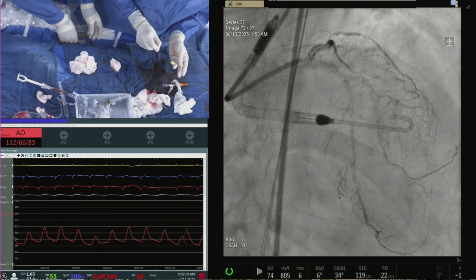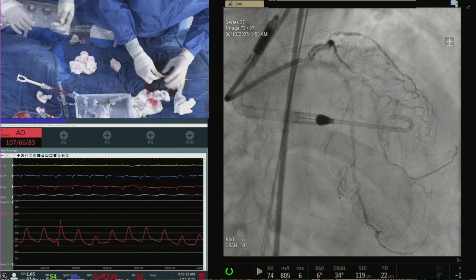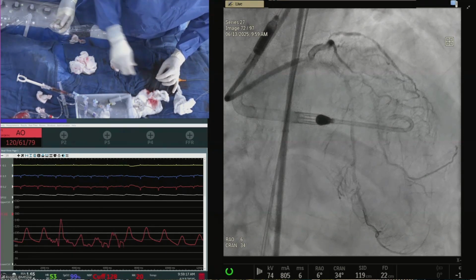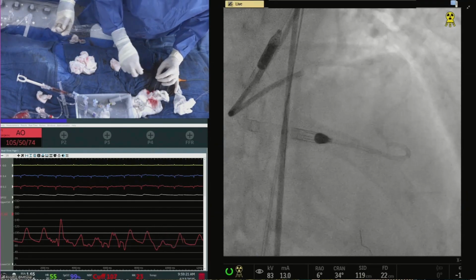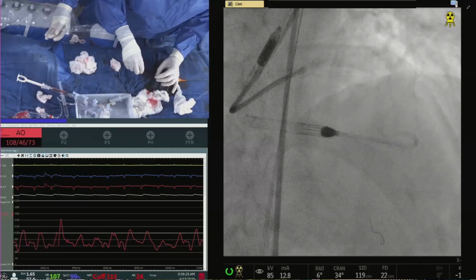Yeah, no, that's what she's doing. I'm sure that's definitely what she's doing, but we want to make sure we get to it. That's a great result, though. Yeah. Anu, nice job. Yeah, thank you. And now get us the balloons, at least 2.5? Yeah, 2.5 by 20 we have, right?